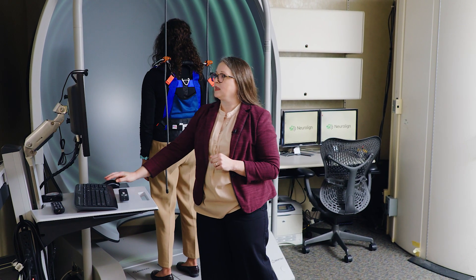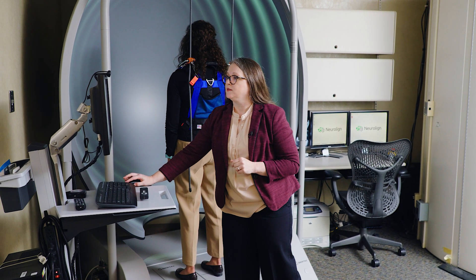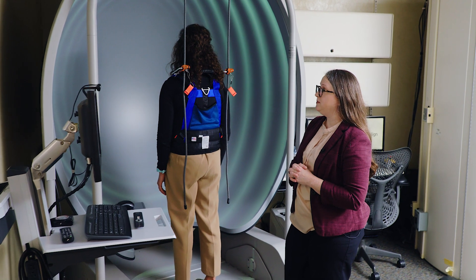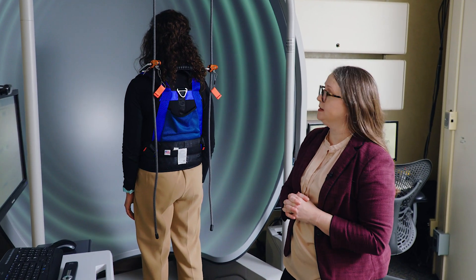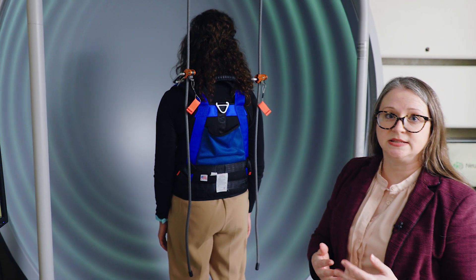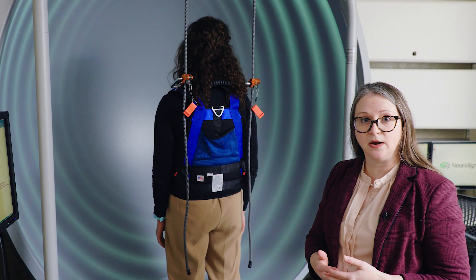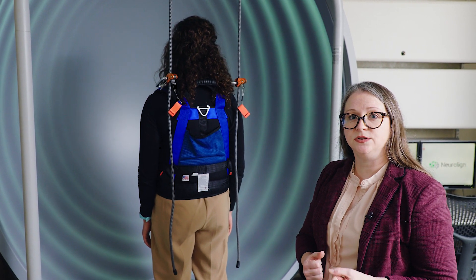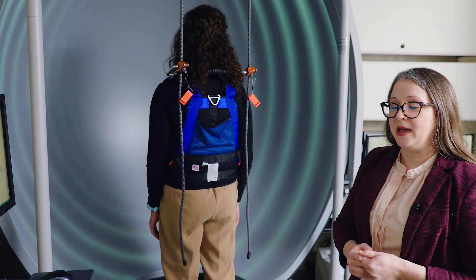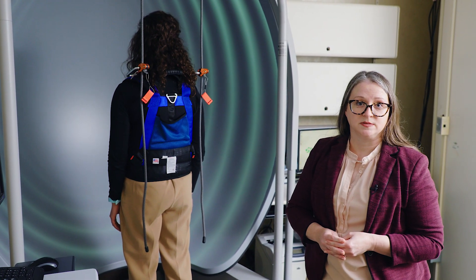We do make these conditions more difficult as we go, with more exciting conditions starting after this. In our third condition, Sarah's eyes are open, but as she moves, the visual surround will also move with her. It's her job to keep it stable and keep balanced. This can be very difficult if a patient has difficulty maintaining balance in busy visual environments or if they're very used to using their eyes to maintain their balance. This test gives them some abnormal visual cues that can lead to more balance problems.